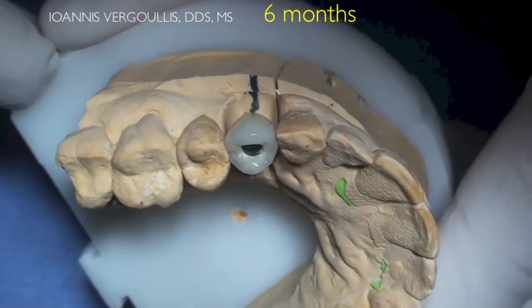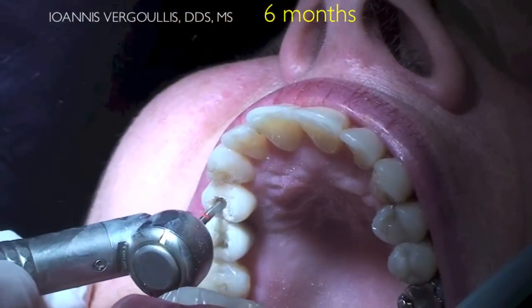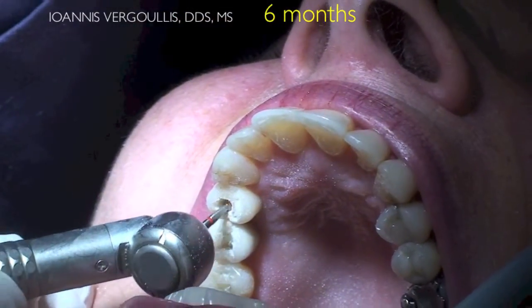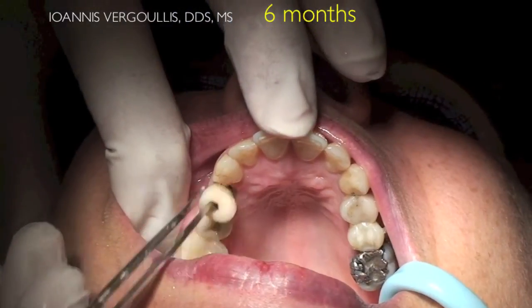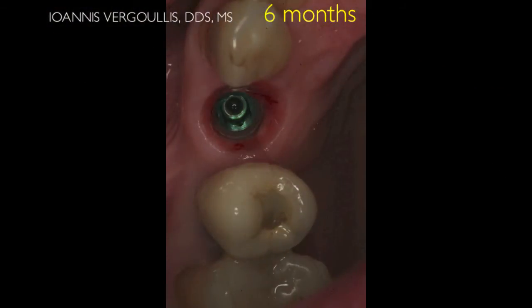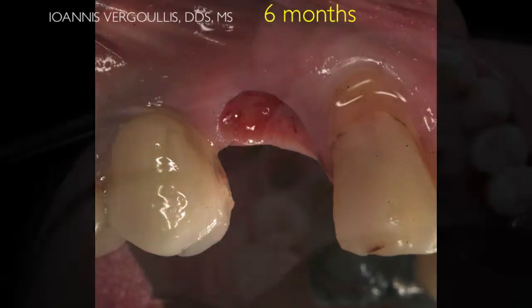The final crown is a screw-retained restoration, porcelain fused to metal. We remove the temporary crown, and you can see that we have a very nice soft tissue profile around our implant, both facially and also occlusally.